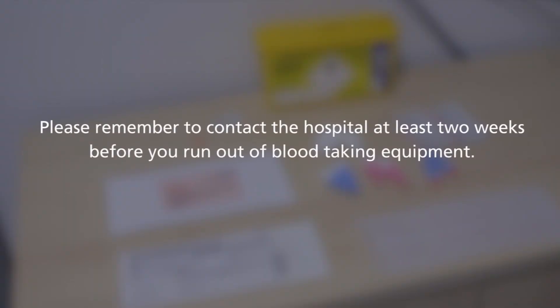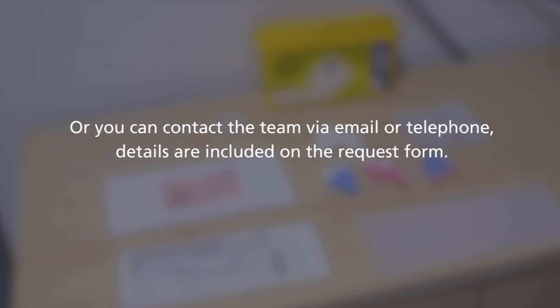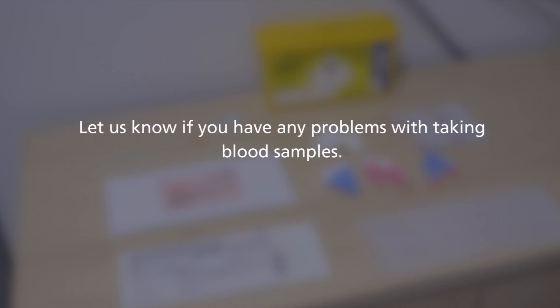Please remember to contact the hospital at least two weeks before you run out of blood taking equipment so we can send more out to you. You will find a request form inside your delivery with your supplies. You can return this with your sample or contact the team on the email or phone number included on the request form. Let us know if you have any problems with obtaining blood samples.